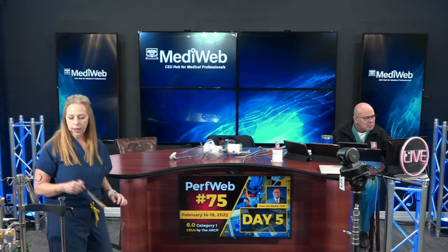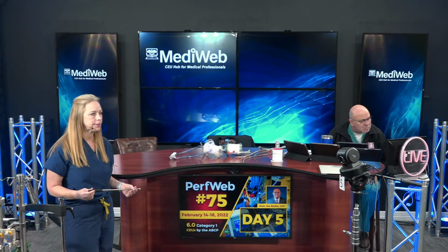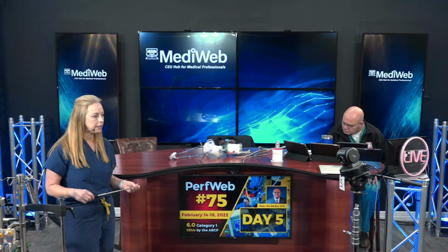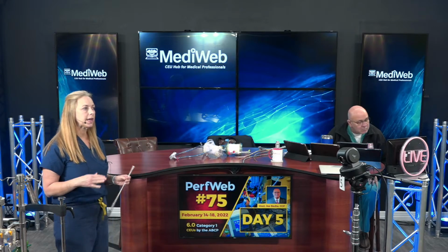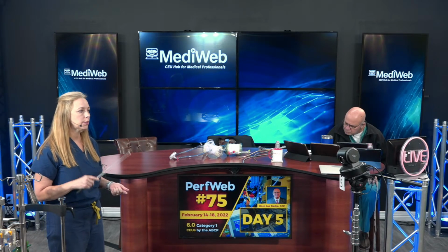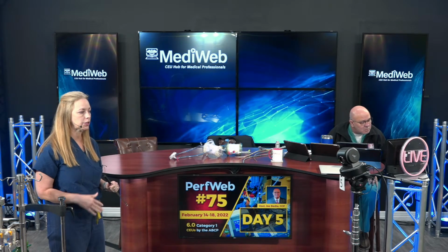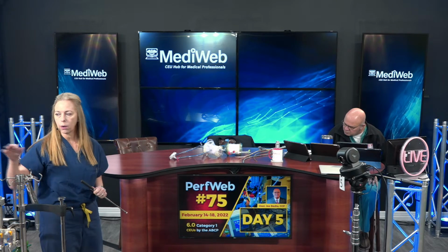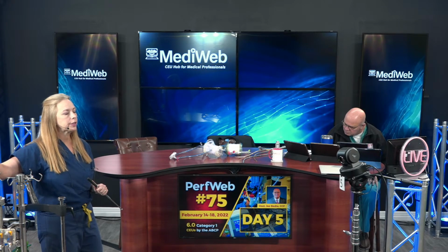Okay, great. So while he's getting that ready, we'll talk a little bit about line chatter. If you are bedside and you're lucky enough to be very near your ECMO circuit, oftentimes when you're starting to have volume loss, unless it's a drastic change, like the line becomes kinked or the patient has moved very quickly, which has changed the cannula position and drainage, your flow on your control monitor will likely start vacillating a little bit.